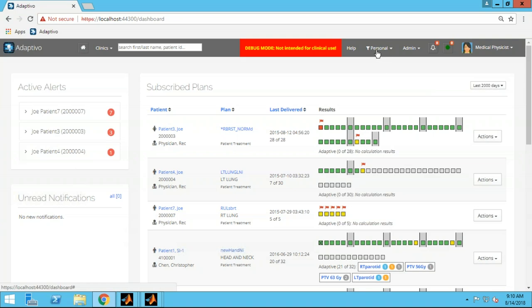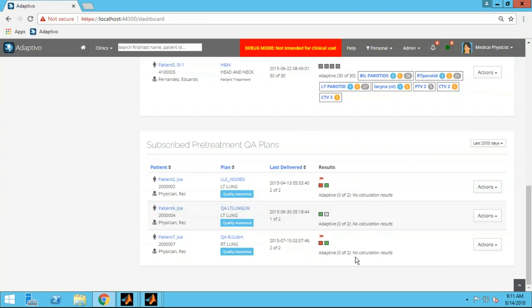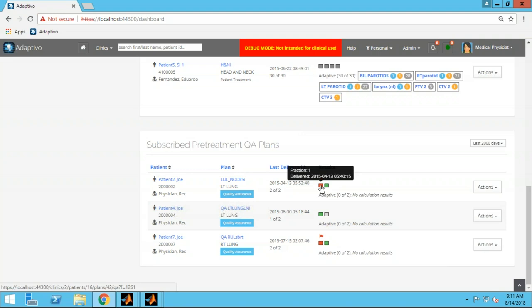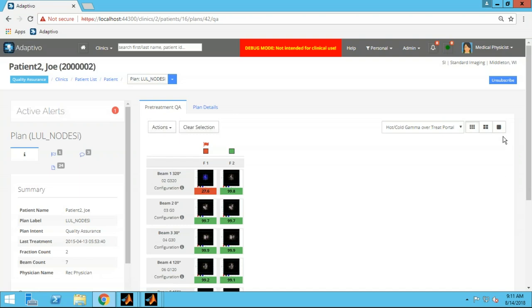If you're a physician filling in for your partner on a given week, you can just say 'show all' and it will show all patients under treatment. At the top of the page we show patient treatment deliveries; at the bottom are the QA deliveries. You can see which patient and plan this was, when it was delivered, and how many times a plan has been delivered. A red, green, or yellow color scheme indicates whether one or more beams was out of tolerance, passed your gamma criteria, or is in the warning range.